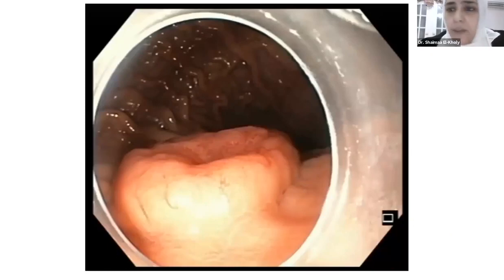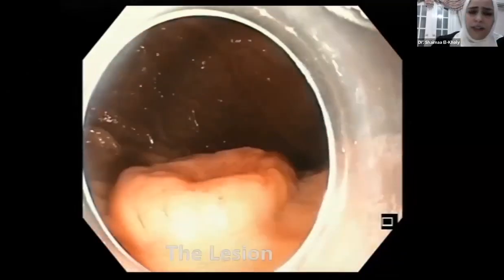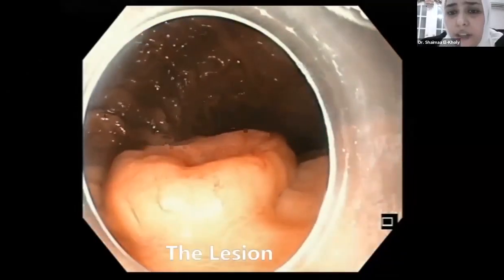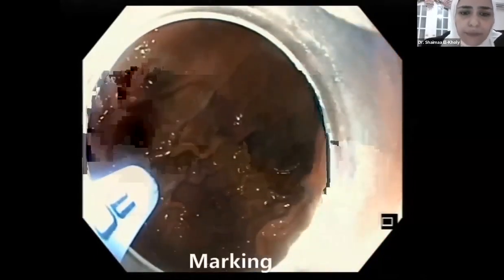Here is a female patient, 42 years old, who presented with GI bleeding. And during gastroscopy, this lesion was found. It's obvious that this is a submucosal tumor. And EUS showed that it arises from the second layer. And here's the video. You can see the lesion is on the lesser curve of the stomach, just below the esophagus. We start with marking using APC.